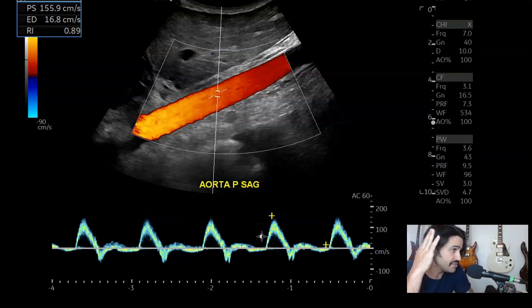Especially if you have a patient that has tachycardia, their heartbeat is going to be much closer together. This is the auto-measure feature — 156 centimeters per second was the peak systolic velocity. It's got a nice clean waveform.